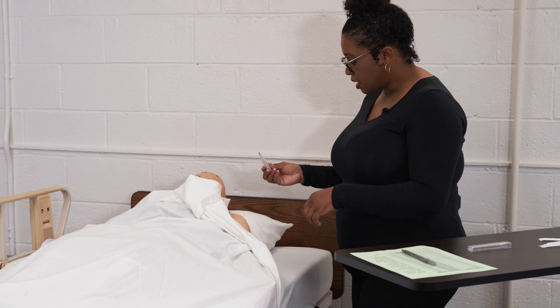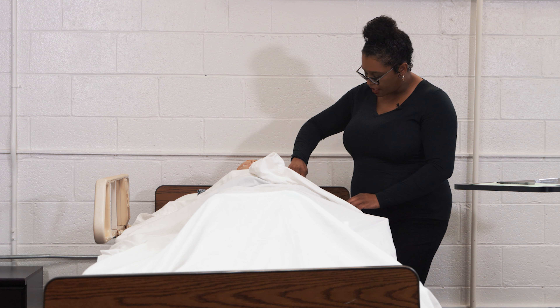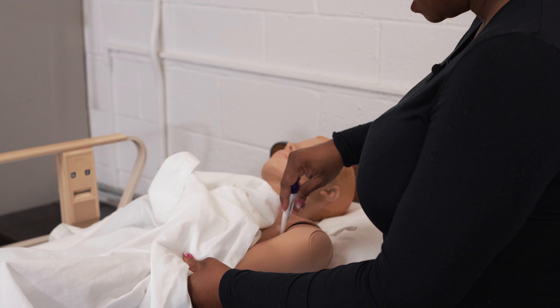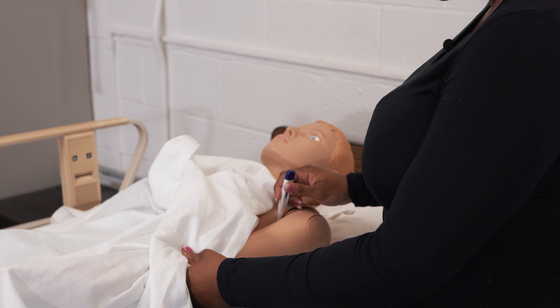Then we're going to take the thermometer and place it in the center of the axilla, or underneath the armpit. We're going to place the arm across the resident's chest, and then turn on the thermometer to activate it.